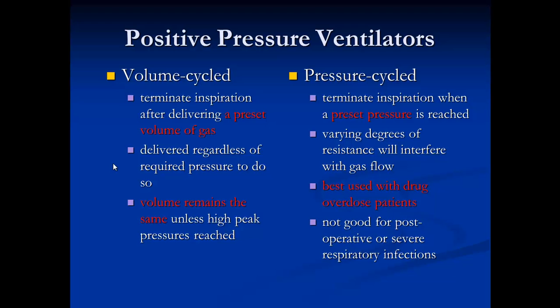It is not good for postoperative or severe respiratory infection, although sometimes when the patients go into refractory hypoxemia, such as ARDS due to sepsis, it is also used, but is not preferred because of the amount of volutrauma and pressure trauma, such as pneumothorax, that this cycle could produce.